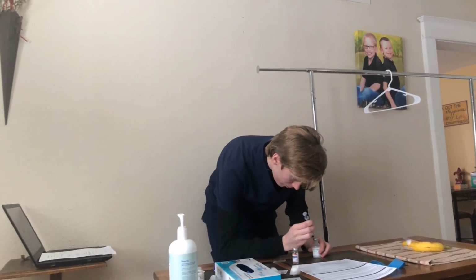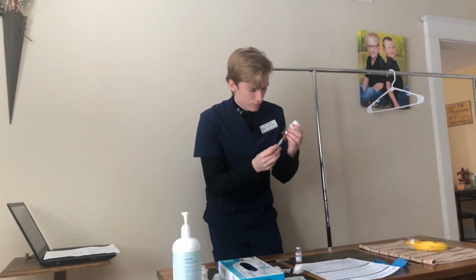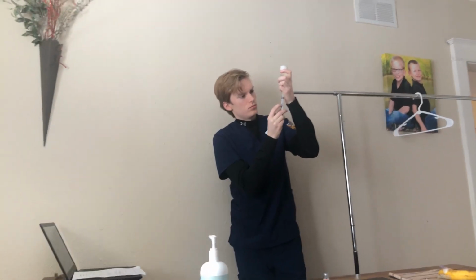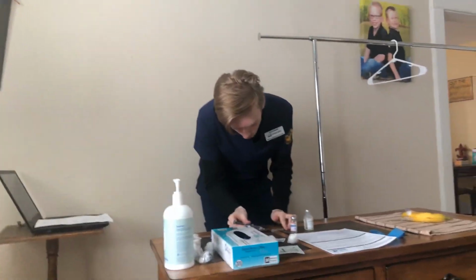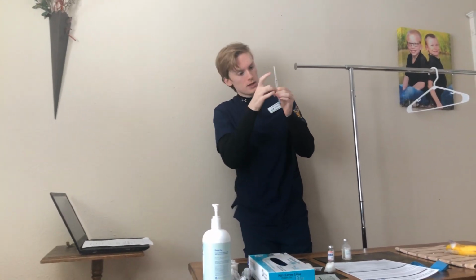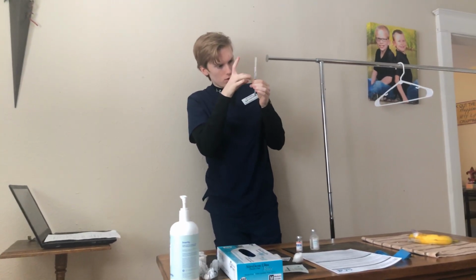Bevel up. This is when I would perform my second check again, that I have the right drug, dose, and it's for the right patient at the right time, and make sure that it's also the right route.